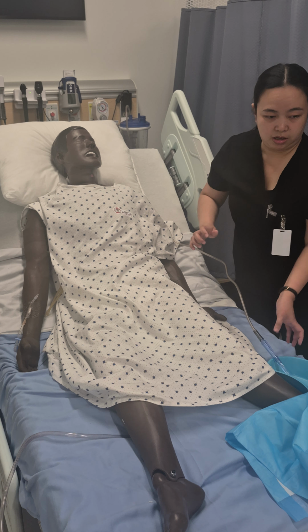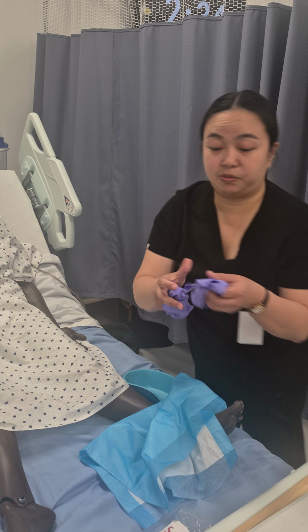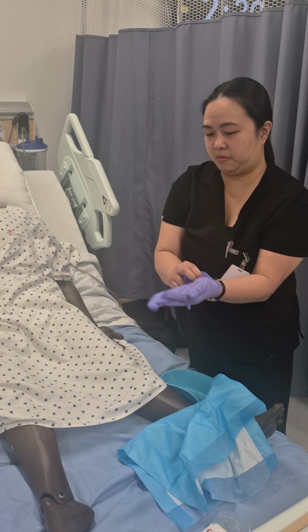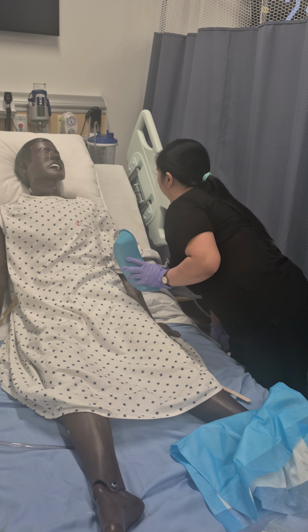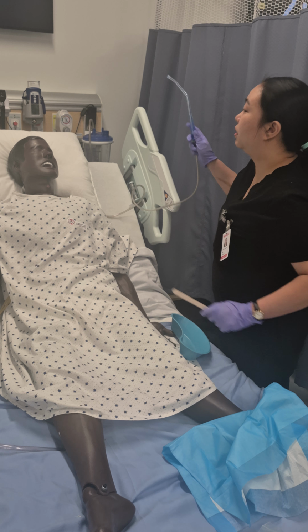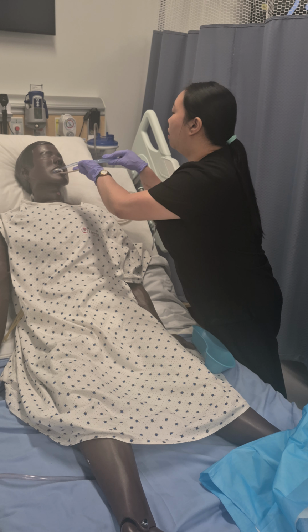Set this up. Now I'm going to do my gloves. And then I'll just start suctioning. Can you please open your mouth, Mr. Smith?